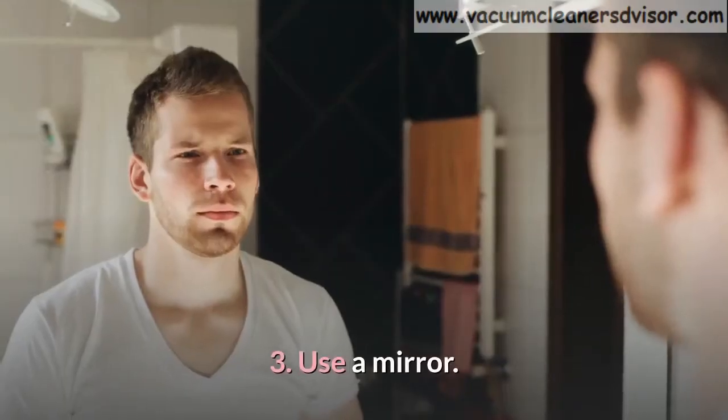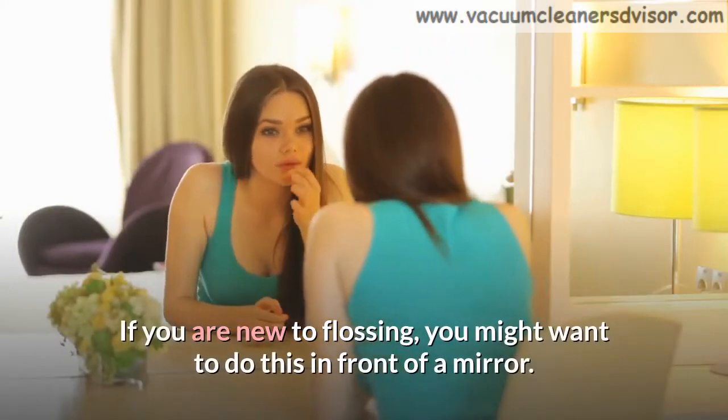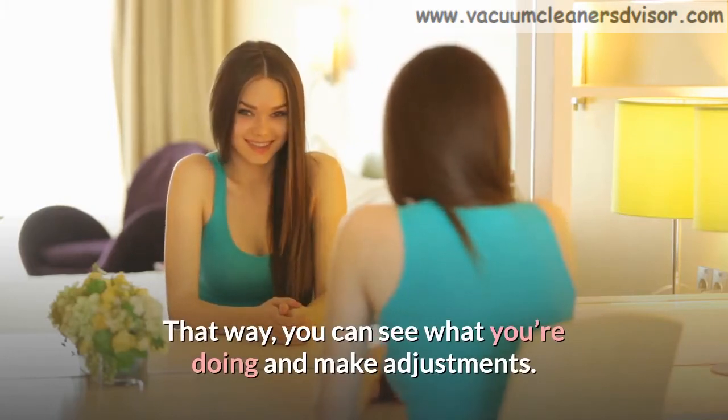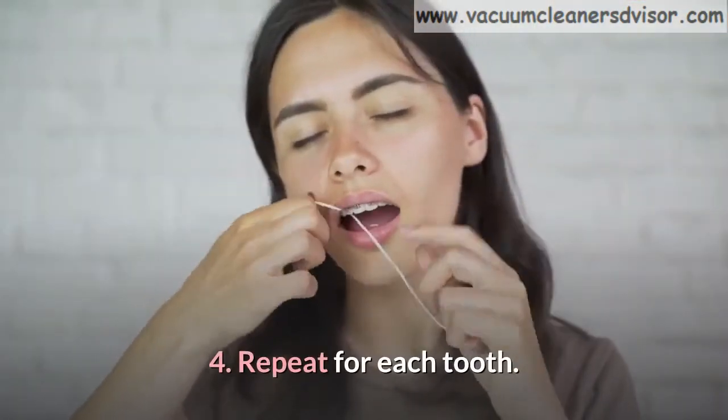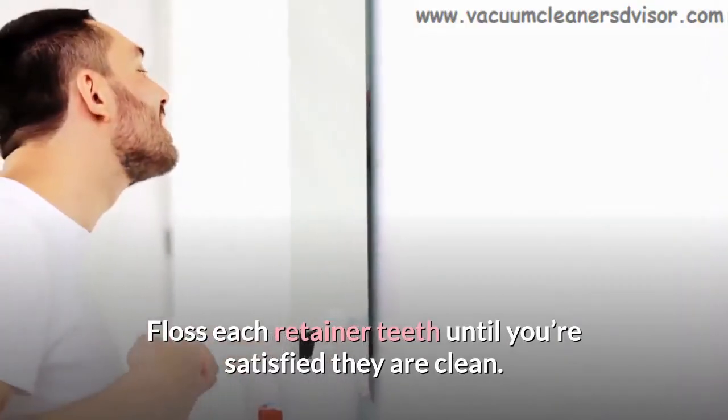Step 3: Use a mirror. If you are new to flossing, you might want to do this in front of a mirror. That way, you can see what you're doing and make adjustments. Step 4: Repeat for each tooth. Floss each retainer tooth until you're satisfied they are clean.